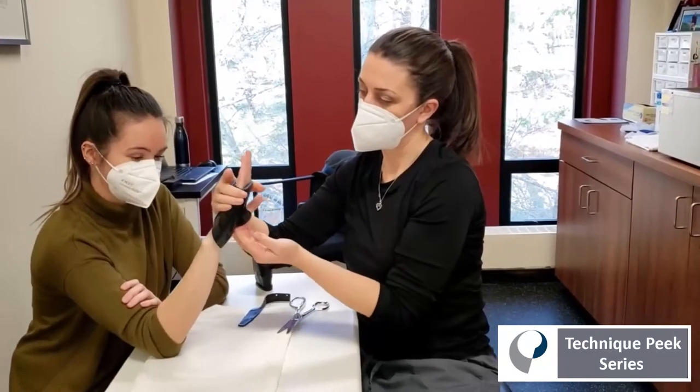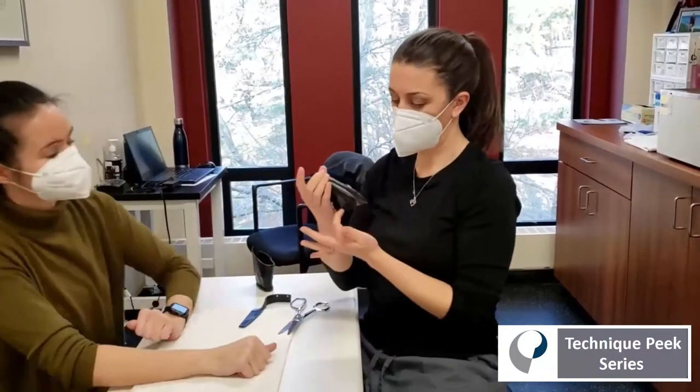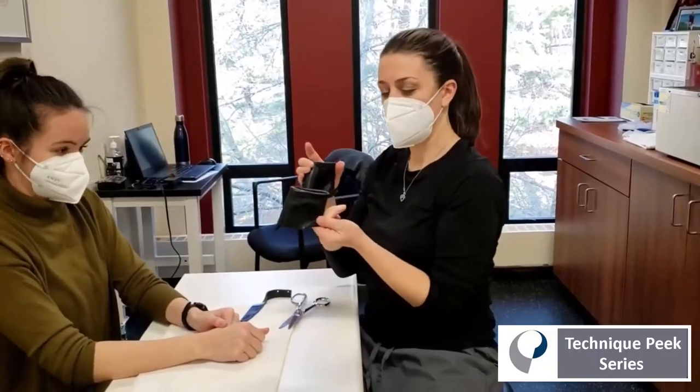Once it's hard, slip it off, you can trim down the extra, and then you end up with your finished piece.